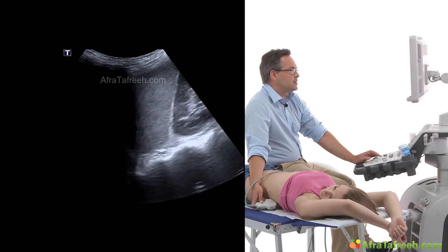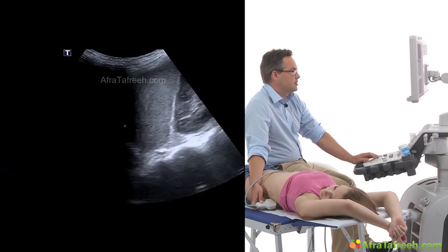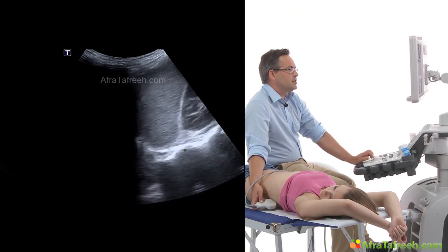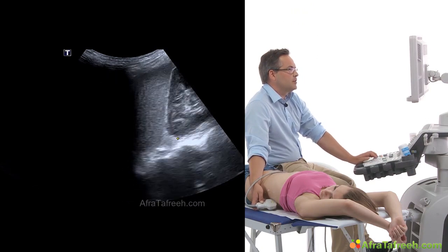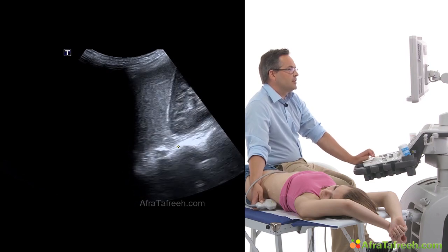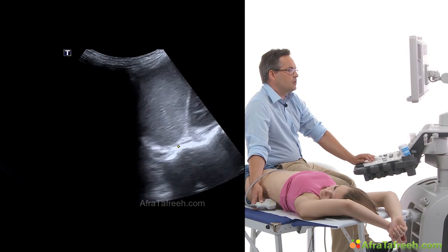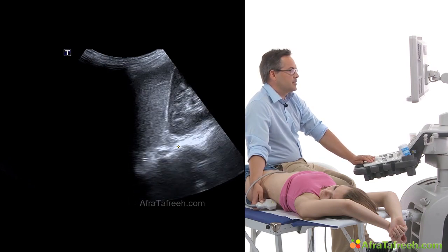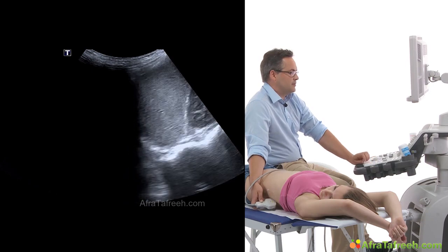So when we scan this region of interest, in between the spleen, the left kidney, and the spine, we can very nicely detect this normal finding on the left adrenal gland over here, and can take a nice picture of it.